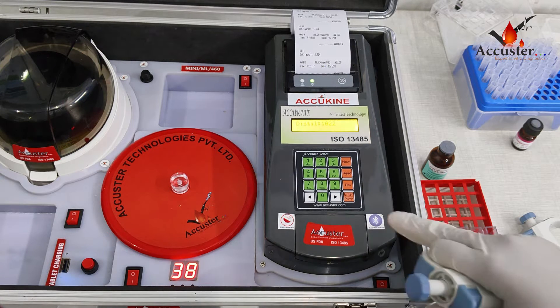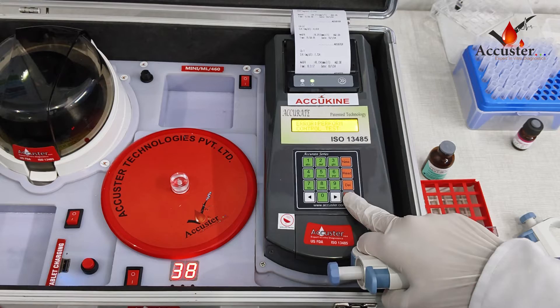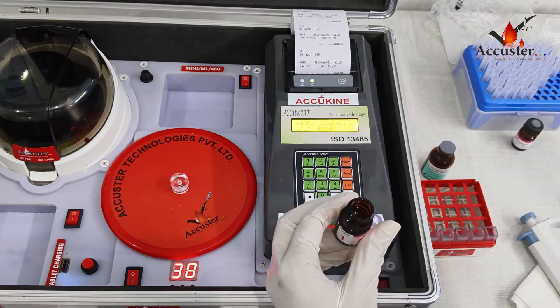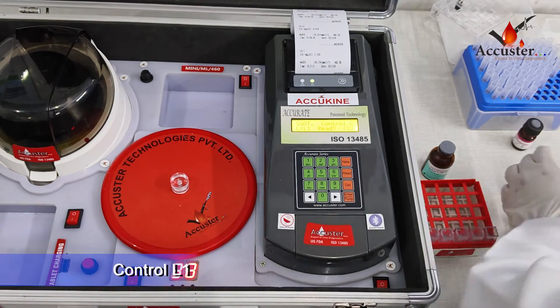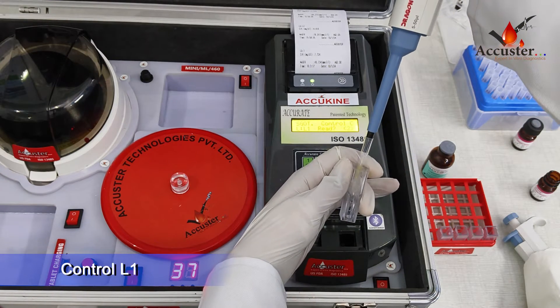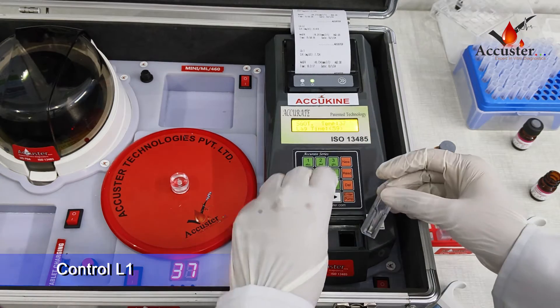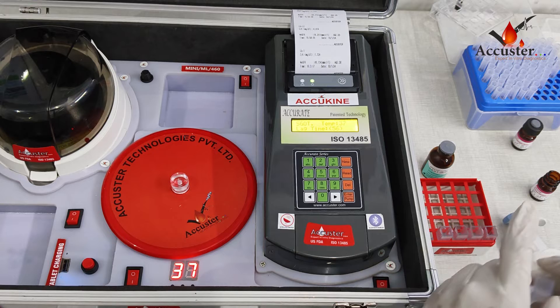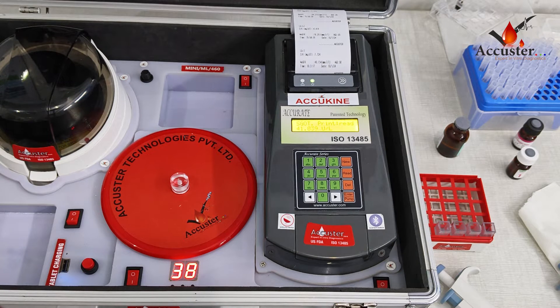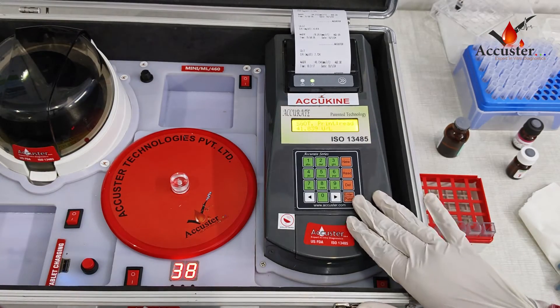Control process: Press 1 to select the SGOT test. Then 'control' will be displayed on the screen. Press ENTER and then the right arrow. Take 500 microliters of reagent and mix it with 50 microliters of L1. Put the cuvette in the analyzer and press ENTER. The reading will appear after 4 minutes. Now we can see the reading.